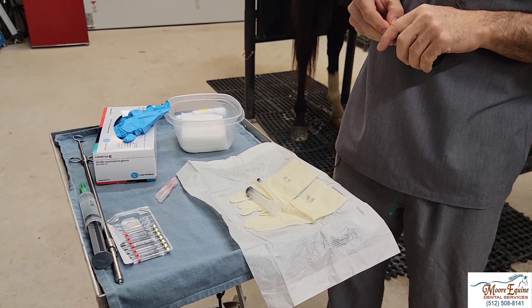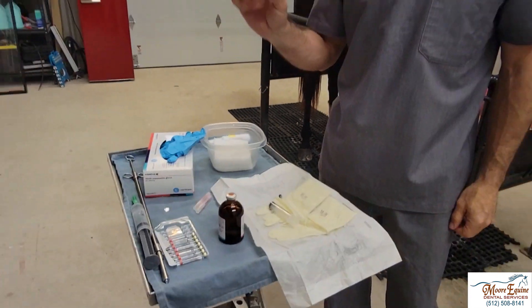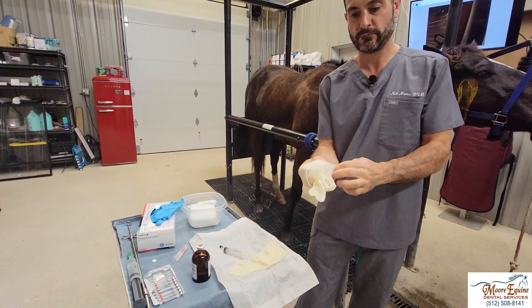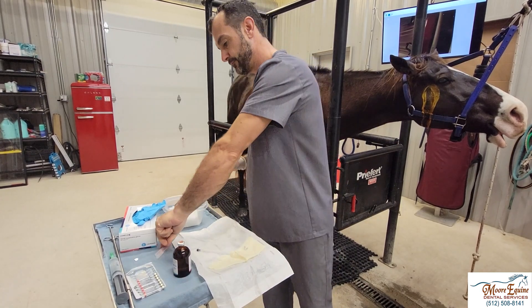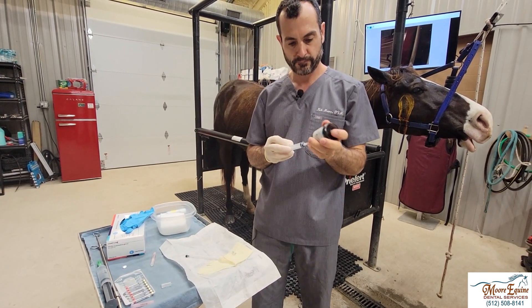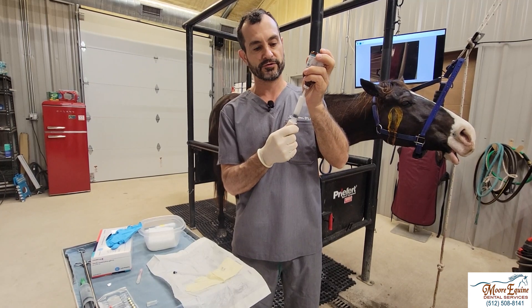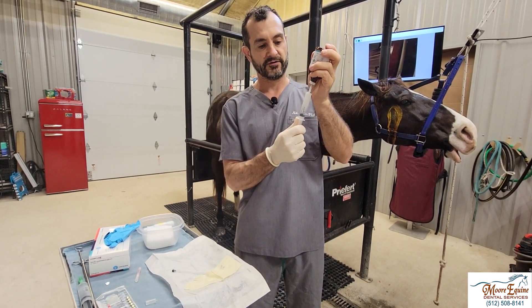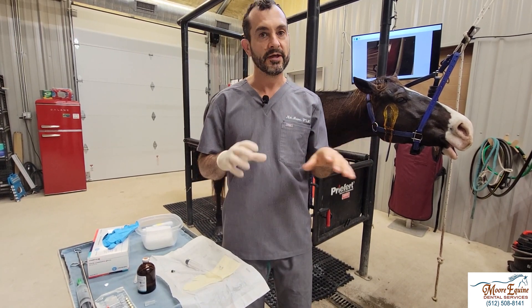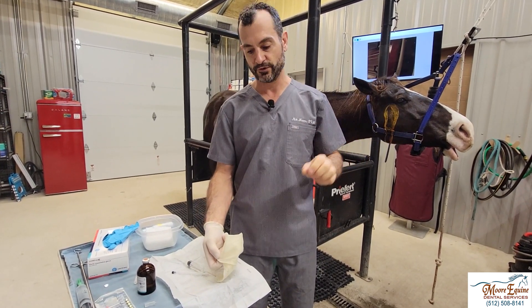I use a 3.5-inch, 22-gauge spinal needle for the injection. I prefer 22 gauge — I don't like to use a bigger gauge because that creates a bigger hole if we enter a blood vessel for any reason. I'm used to doing a lot of these by myself, so this is how I do it. I use my sterile gloves. It is nice to have someone hold the horse, but I've done hundreds by myself without issue, as long as the horse is well sedated. You have to read the horse — make sure it doesn't seem too spooky or too awake or uncomfortable, and address that before you do the nerve block.